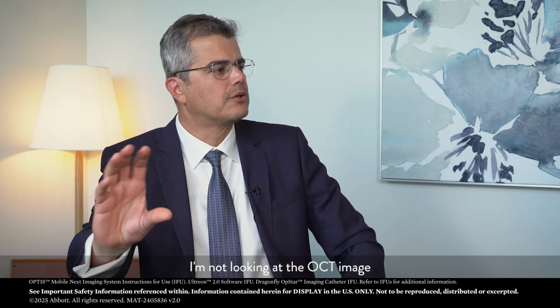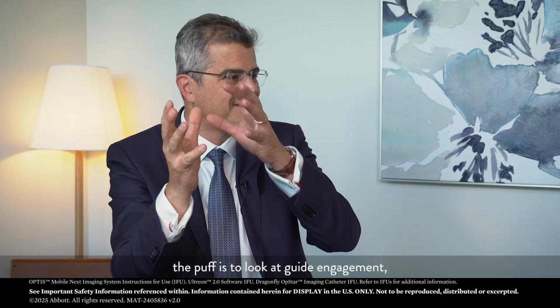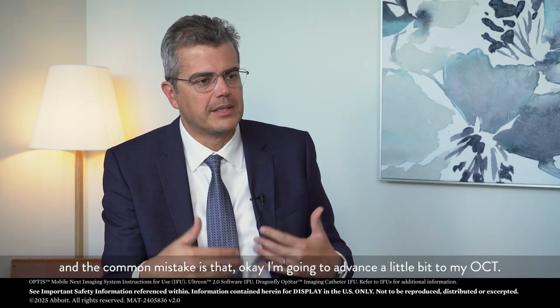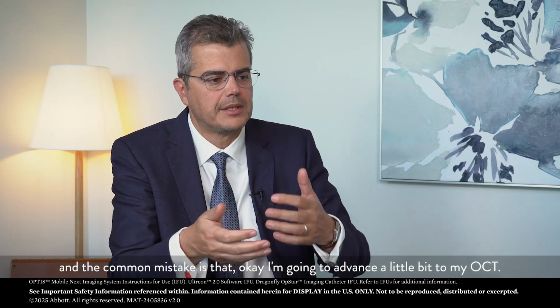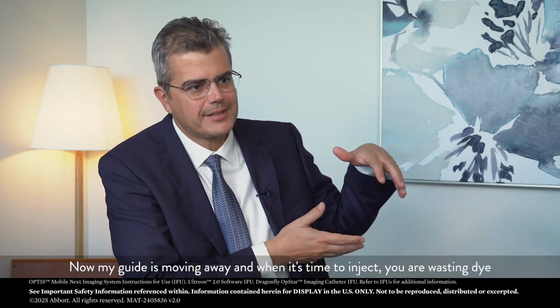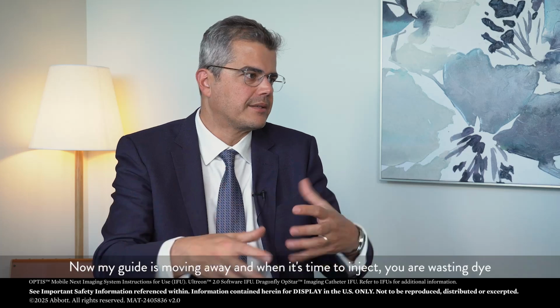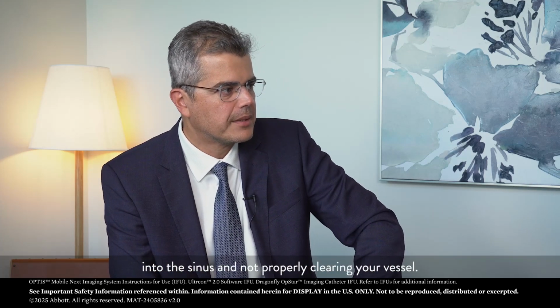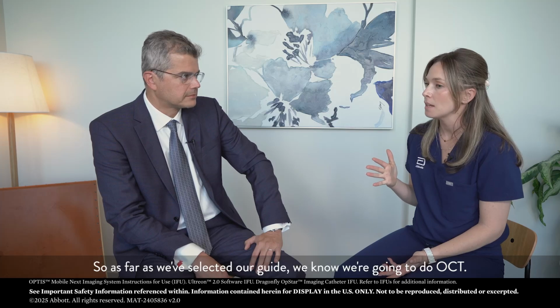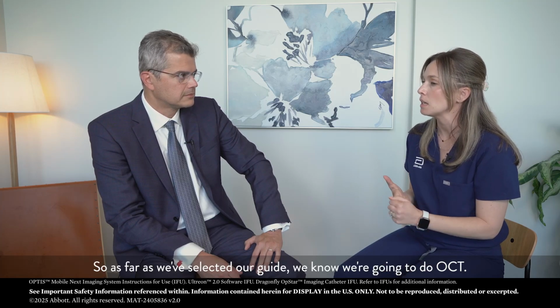I'm not looking at the OCT image. The puff is to look at guide engagement. And a common mistake is that, okay, I'm going to advance a little bit my OCT. Now my guide is moving away, and when it's time to inject, you're wasting dye into the sinus and not properly clearing your vessel.